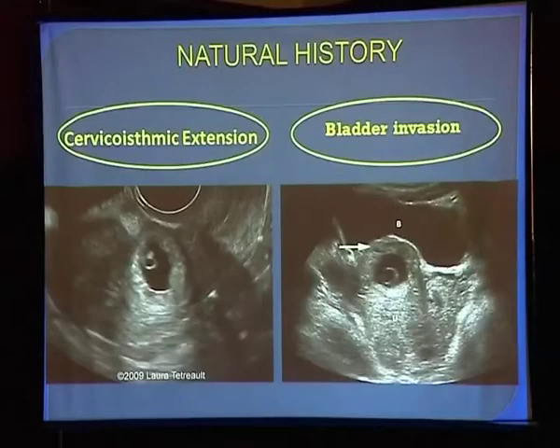Good morning, everybody. Coming to my topic, morphology and clinical significance of Caesarean section scar. As the Caesarean section rate is increasing in the last few decades, the number of women with Caesarean scar is increasing. Caesarean section improves the neonatal outcome, but it is also associated with long-term complications like Caesarean scar pregnancy, dysfunctional uterine bleeding, chronic pelvic pain, apart from the well-known complications like pathologically adherent placentas and uterine rupture. The nomenclature to describe Caesarean section scars examined using ultrasonography has been very recently published in the journal Ultrasound in Obstetrics and Gynecology in the month of August.